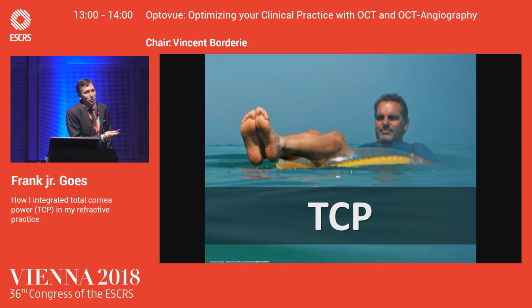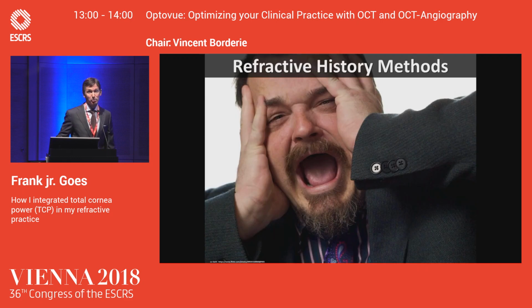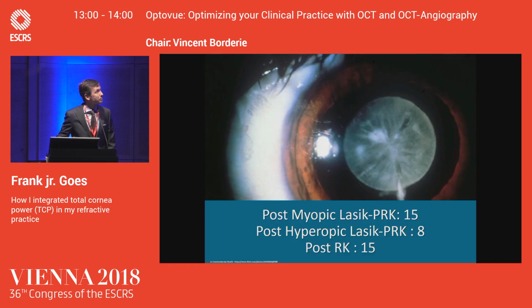First of all, you have to know that the methods that don't use a clinical history are much easier for the surgeon. You can have time off in the weekend. We don't want to spend all the weekend in front of the computer or calling colleagues to have access to preoperative data that sometimes you will find, but sometimes you will not find. If you can just measure without clinical data, it's much easier.